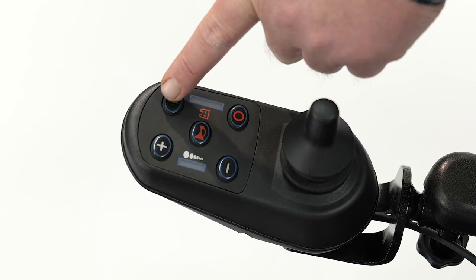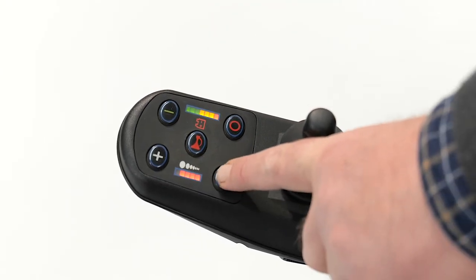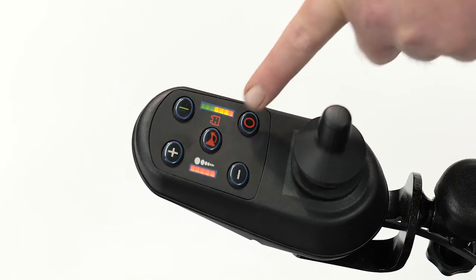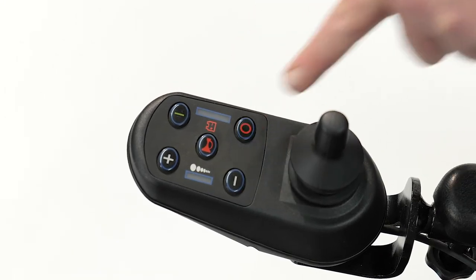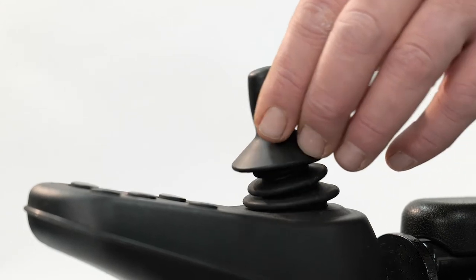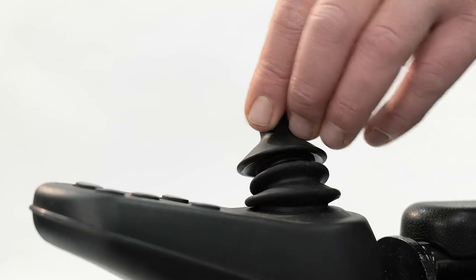Switch on. Here we have speed control and a horn, and off. Here is where you guide your power chair forwards, reverse, or to either side.